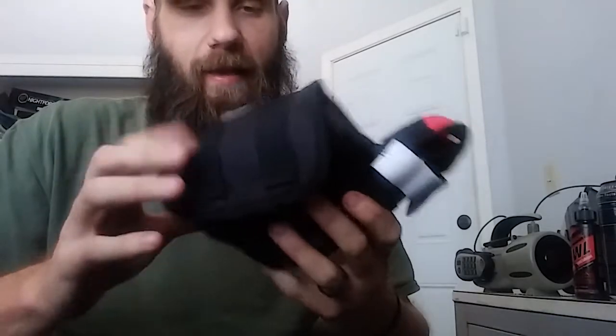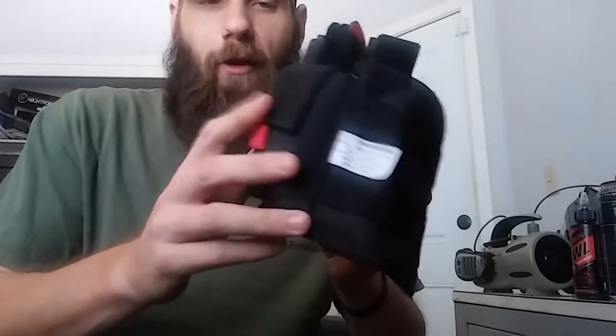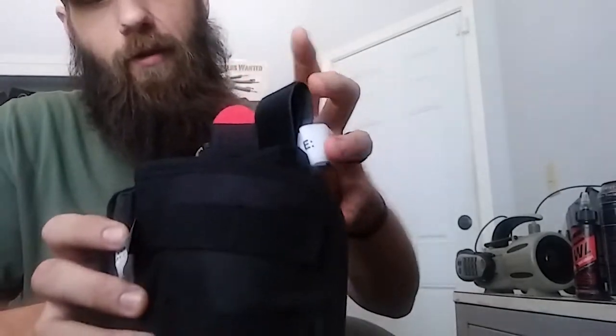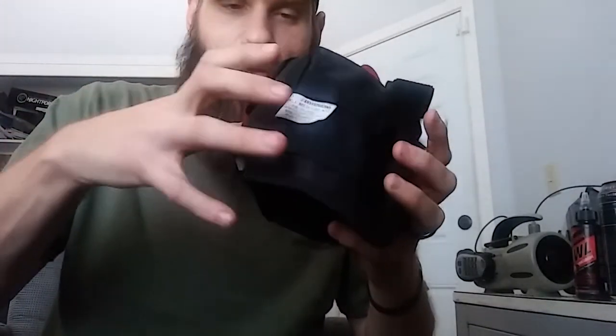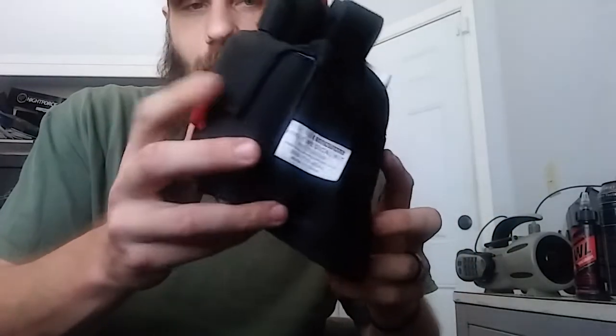Now it's kind of big as far as being packed up like that. You've got to wear a loose-leg pant to cover this, and it may even stick out a little bit because this bandage may print a little bit. It didn't do it as bad when I had 1 CAT in it. When I put 2 CATs in it, it doesn't completely stretch my pant leg over it, but if you know what you're looking for, you can see a bulge of this deal sticking up here because you're taking up all the free space in your pant.